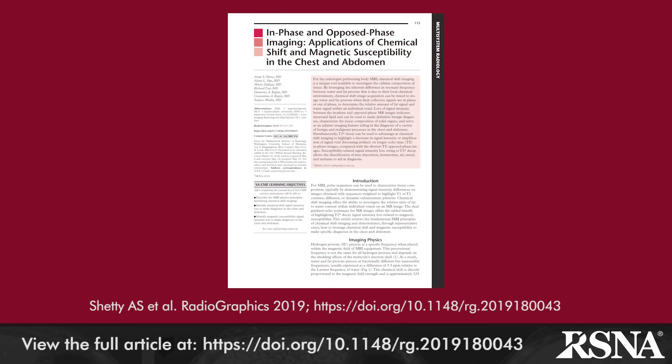Chemical shift imaging affords the radiologist the opportunity to assess the cellular composition of tissues.